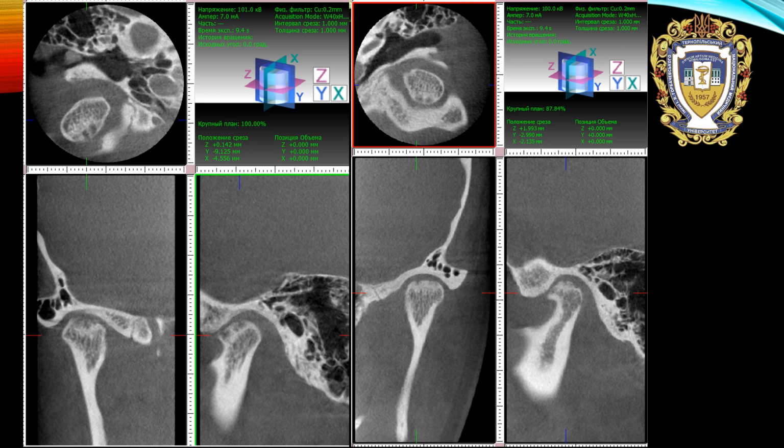we found many interesting things, like these cavities and strange structure. Strange structure of condyles.